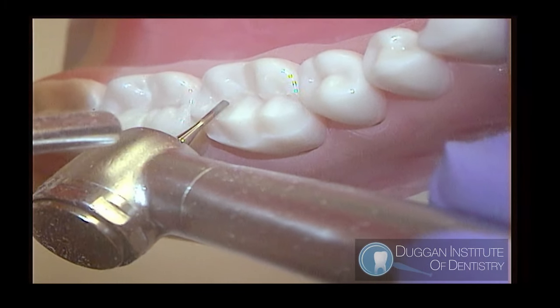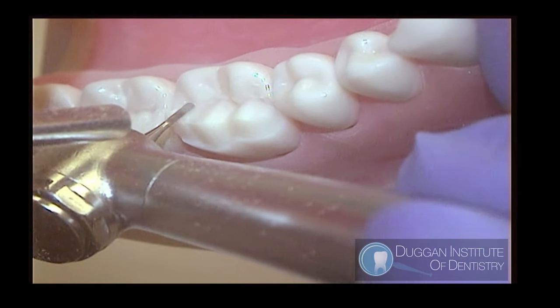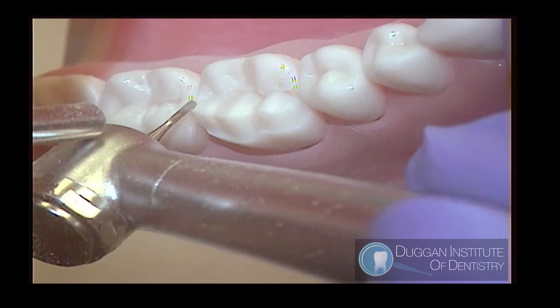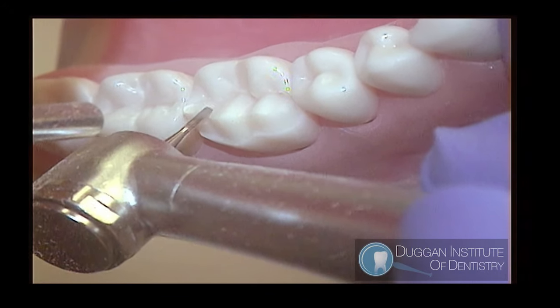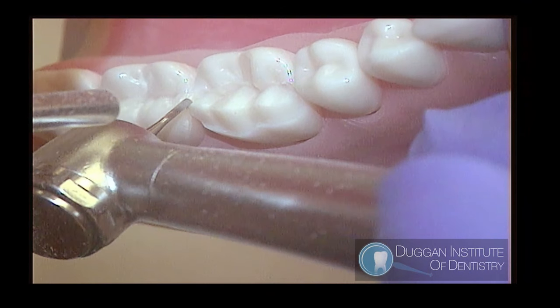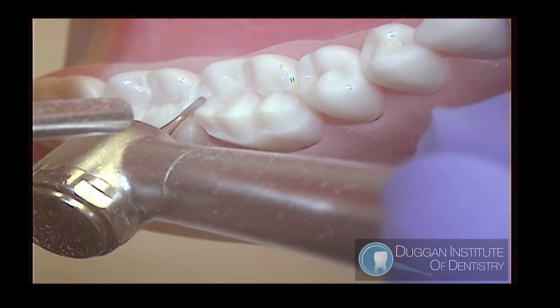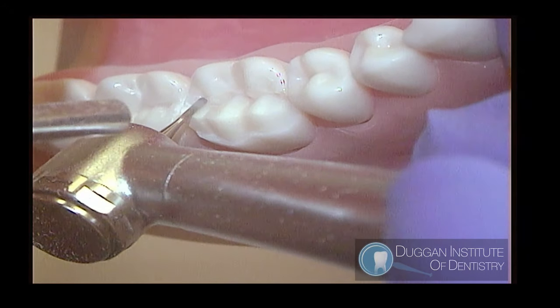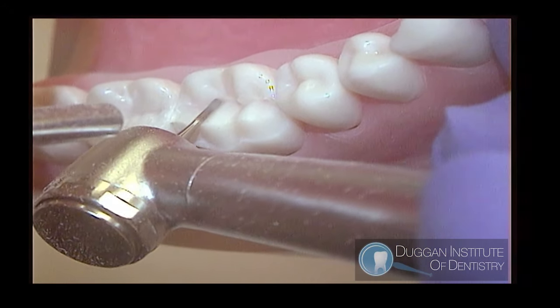Now we can reduce the distal cusp. Angle the burr slightly tangent to the adjacent tooth. Take the angle from the matching adjacent cusp. Point the burr and follow the central groove. Reduce the cusp flat and then round the ridge.